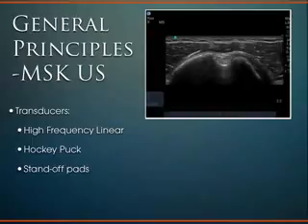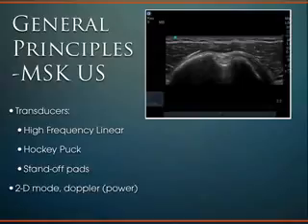There's also something called a standoff pad. It might have been mentioned at some point during some of your lectures, but when you're looking at the transducers, there's a certain focal point for those sound waves and for the crystals. And the focal point is a particular distance from the transducer, kind of like how our eyes function. And so if you're imaging a finger and it's a really tiny small joint and the transducer is right next to the probe, that focal point could be past the joint or too deep. And so the standoff pads basically are something you can put on top of the finger or on top of the area. It brings the probe up off of the anatomical region and it focuses the focal point more appropriately. So just something a little bit more specific to MSK.